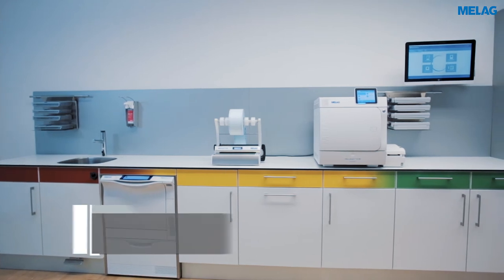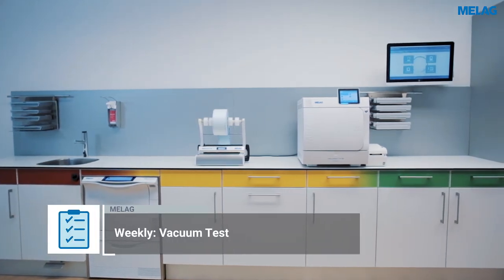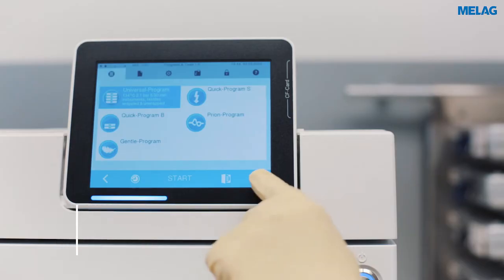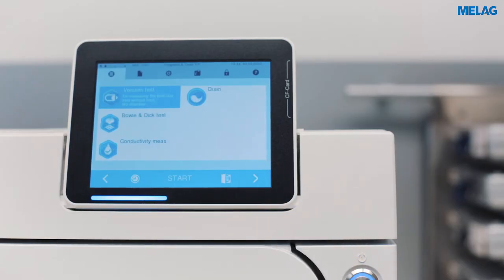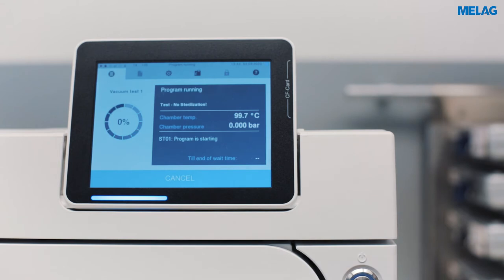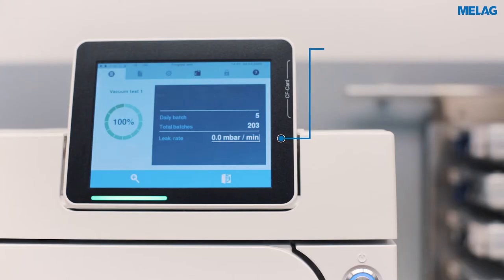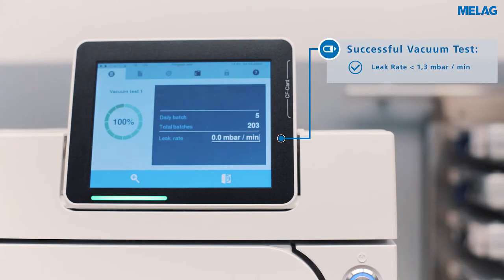Additionally, perform the vacuum test weekly with a cold and dry steam steriliser before starting work. To do so, select the vacuum test in the test program overview and press start. The steam steriliser is checked for leaks in the steam system. The vacuum test is successful if the leakage rate is lower than 1.3 millibars per minute.